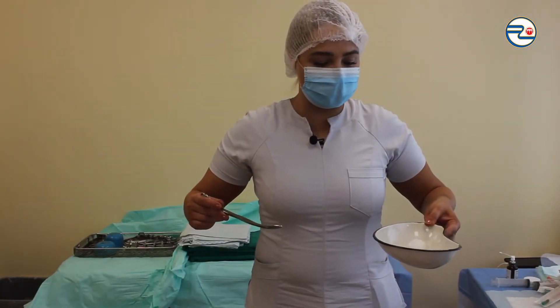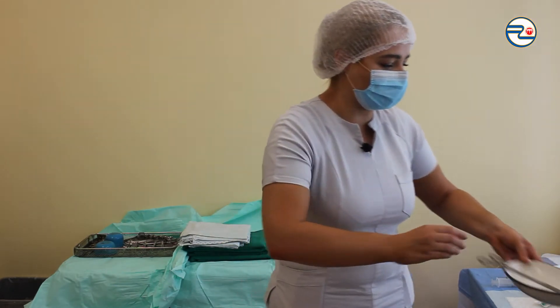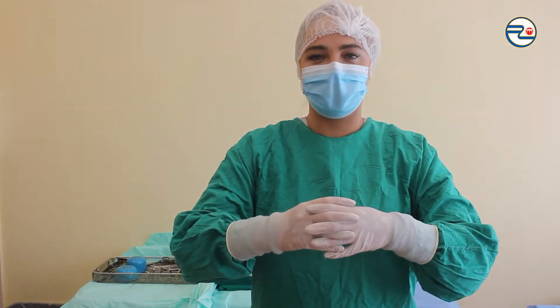Putting the bowl and instrument on a non-sterile surface without compromising sterile condition. Waiting until the surgical field becomes dry. Putting on sterile gown and gloves.